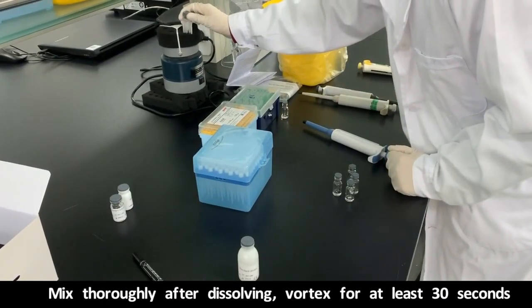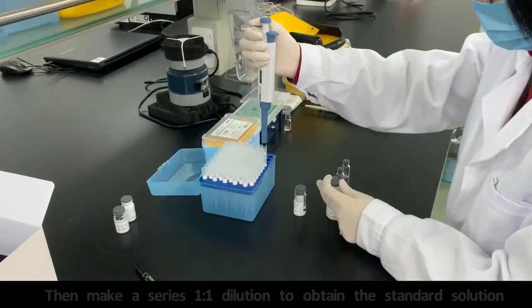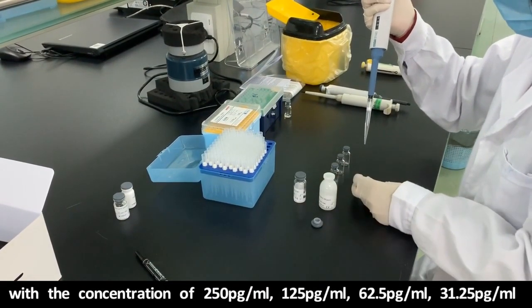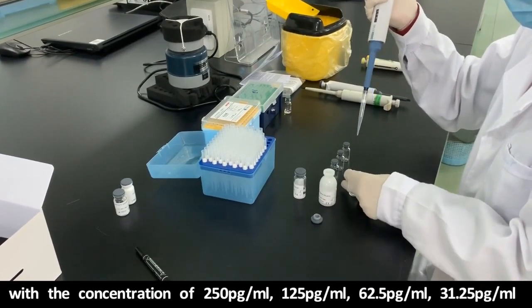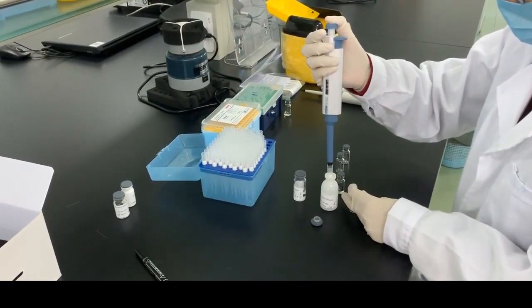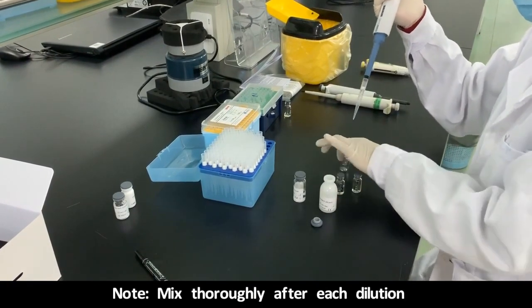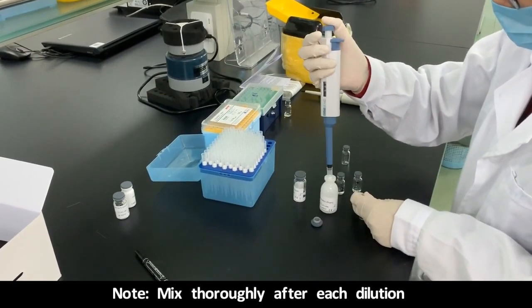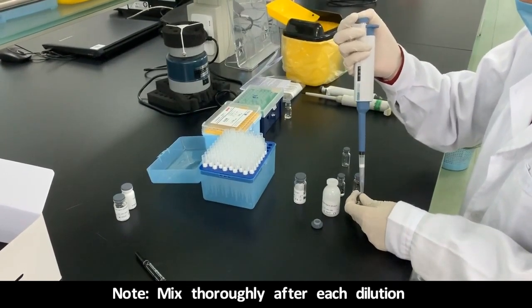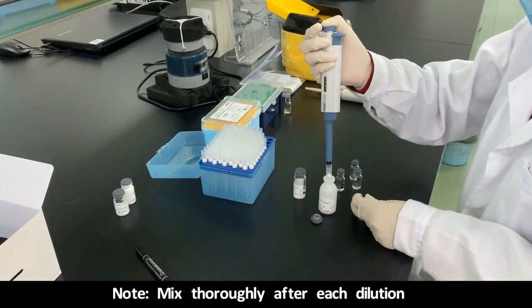This should then be thoroughly mixed, vortex for at least 30 seconds to ensure that there's complete mixing. Then a set volume is pipetted into each of the lower concentration vials, and these are kept in sequence to ensure that you know which one is which. And subsequently, an equal volume of the standard is pipetted from one to the next to produce the dilution series.